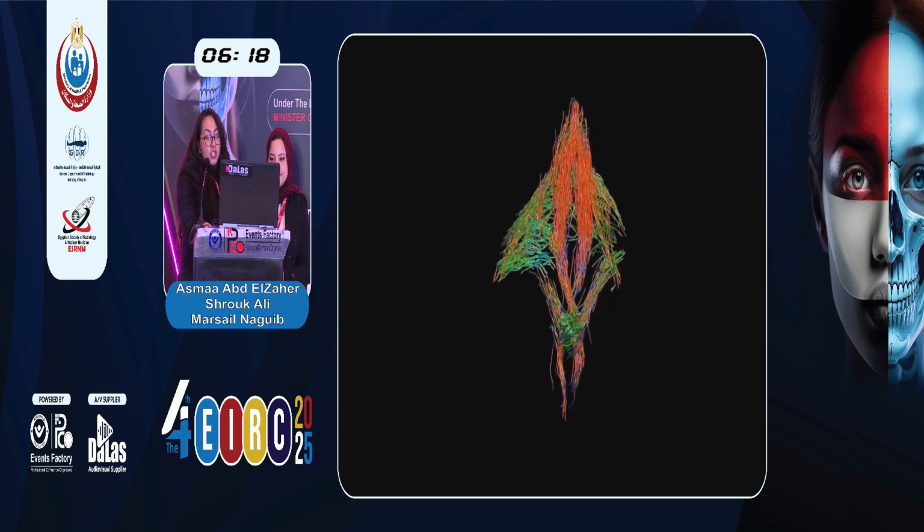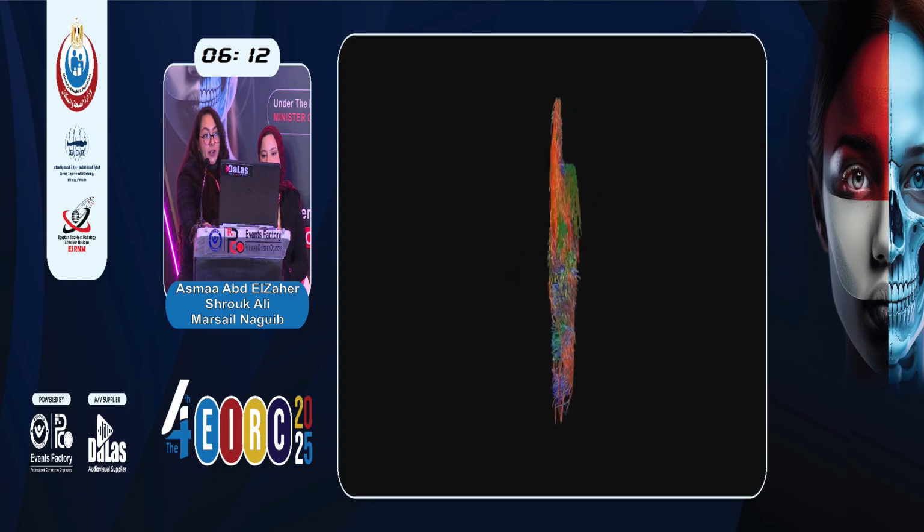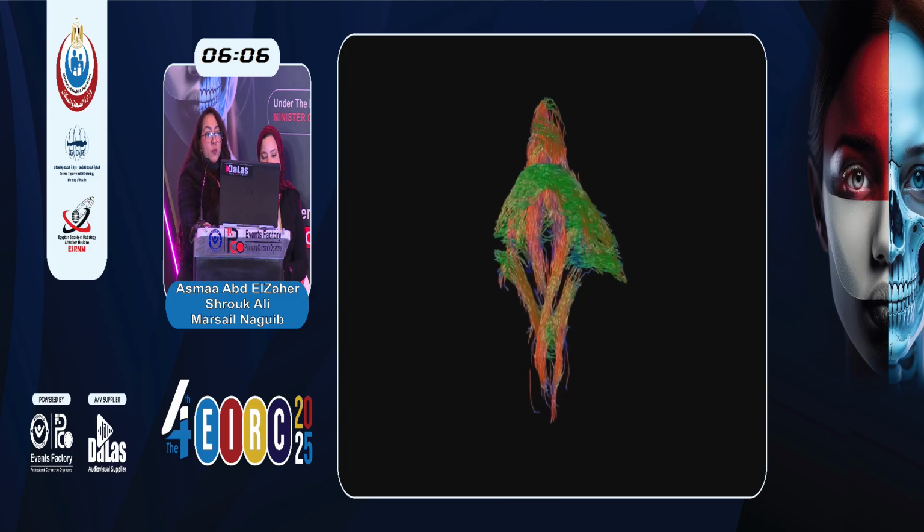We have an animation of the 3D tractography of pelvic floor muscle, with each color representing a different direction. For example, the red represents right to left, green anteroposterior, and the blue craniocaudal.